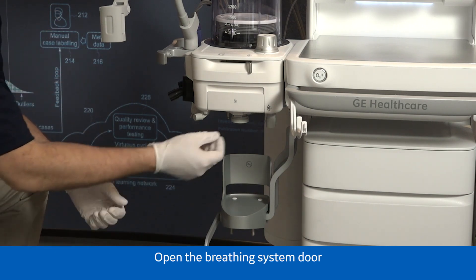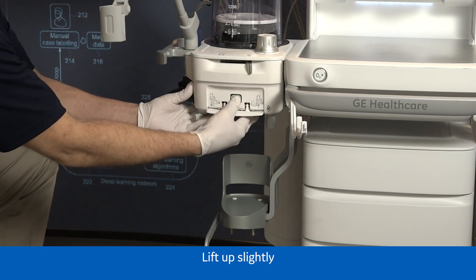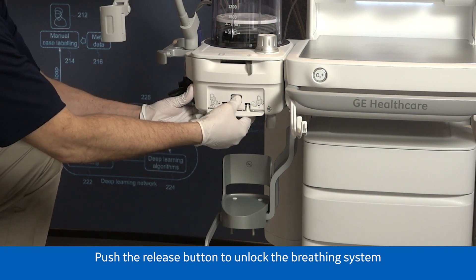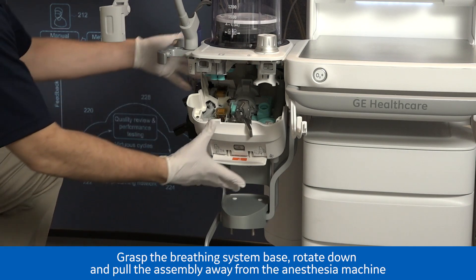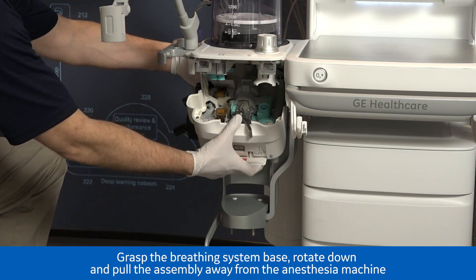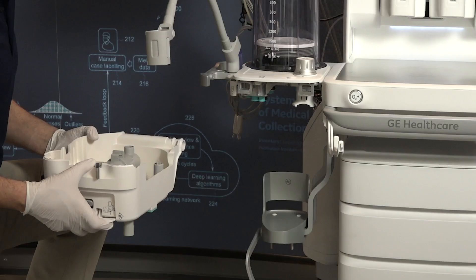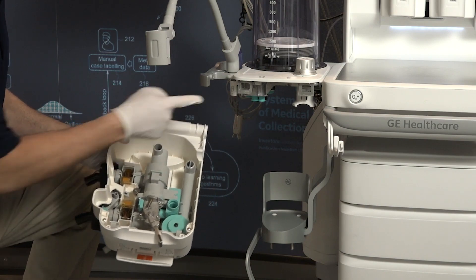Open the breathing system door. Lift up slightly and push the release button to unlock the breathing system. Grasp the breathing system base, rotate down, and pull the assembly away from the anesthesia machine. If there is not an integrated gas module, remove the O2 cell from the connector.